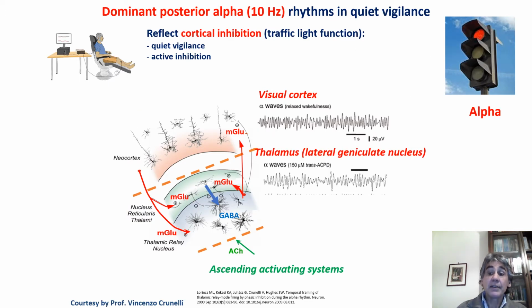The EEG alpha rhythms in the resting state are prominent in the posterior scalp regions and the posterior cortical areas. They reflect cortical inhibition in relation to no visual or auditory stimulation and psychophysical relaxation.